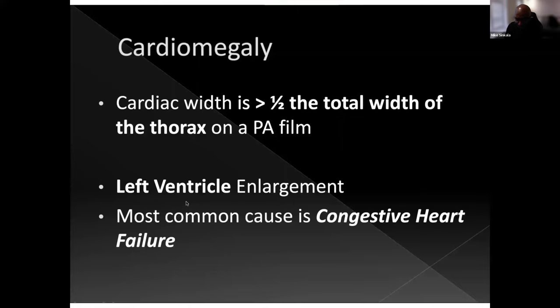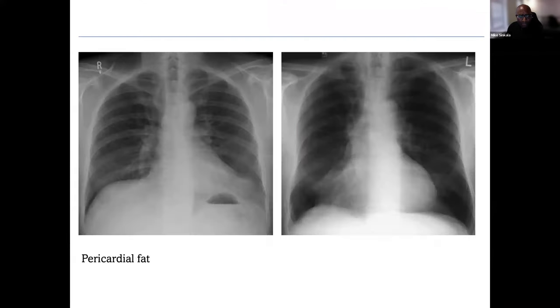So when you do a chest X-ray and you see a left ventricle enlargement, normally this would be associated with congestive heart failure.